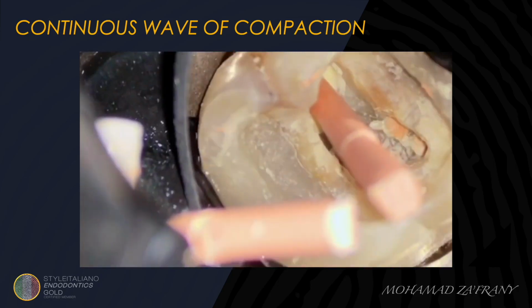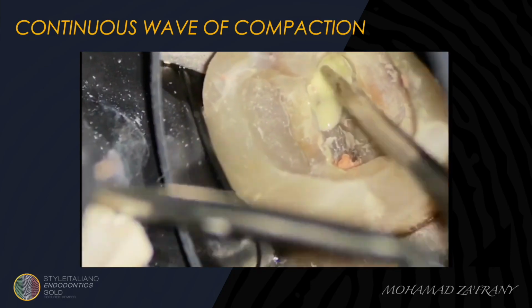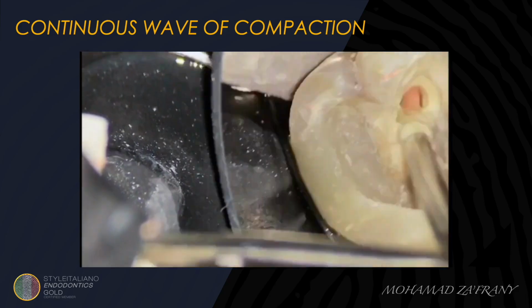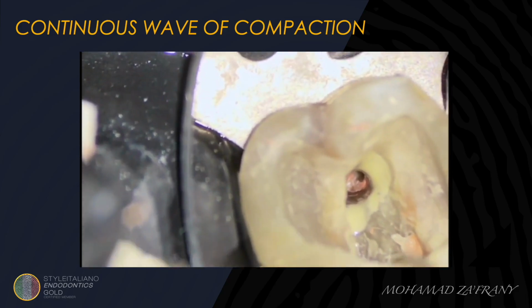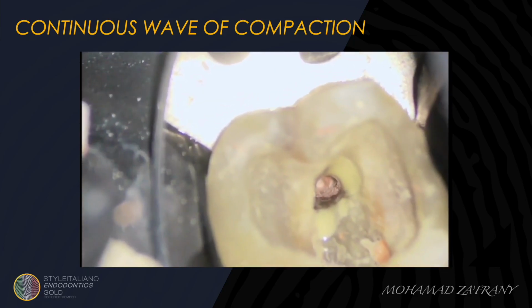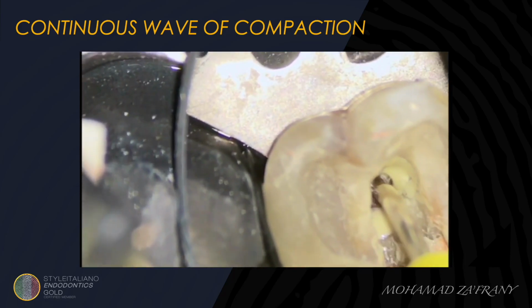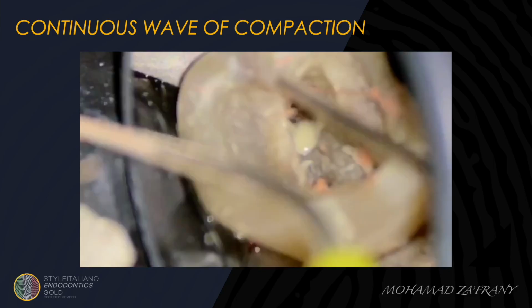Same steps for the palatal canal. Here I'm using a larger plugger or larger heat carrier because the canal was already wide. Compaction, filling to the middle third, compaction, and here's the coronal third.